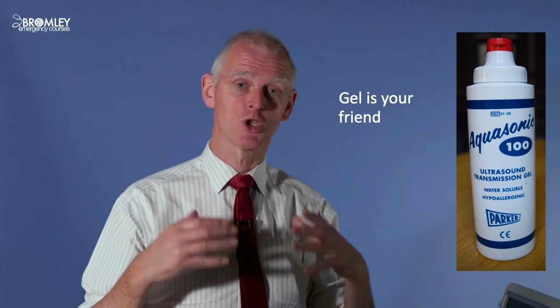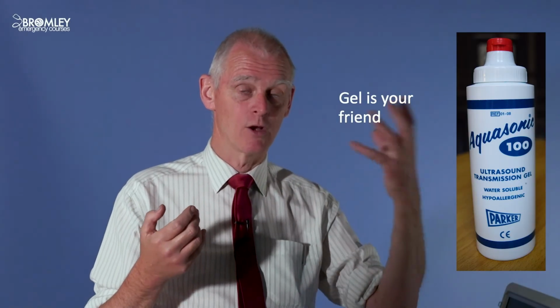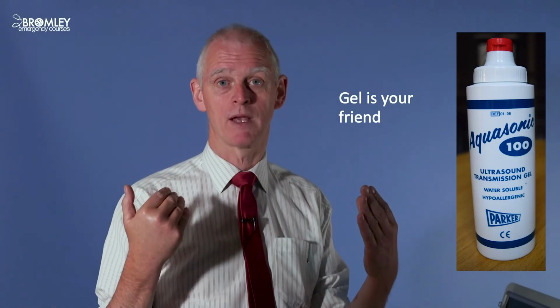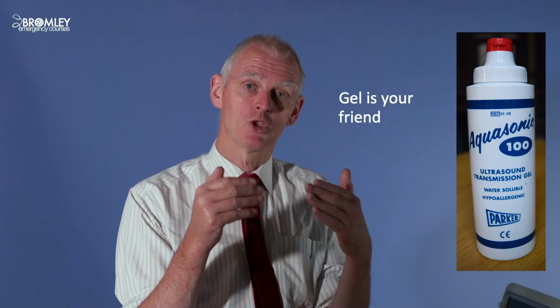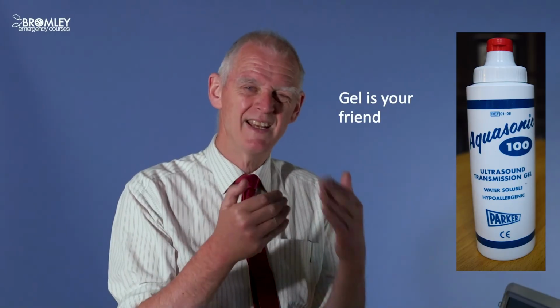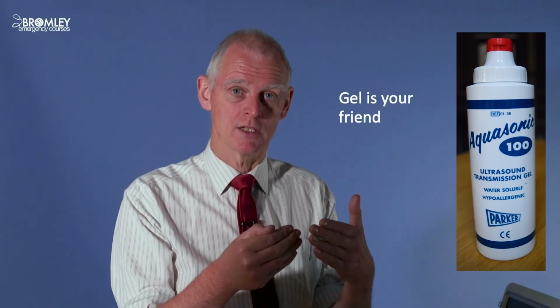So what is it that makes ultrasound bounce? If you think about shouting across a valley to a cliff, you hear the echo from the cliff on the other side. What is it that made that sound bounce back from the cliff towards you? Well, it turns out to be changes in the speed of sound. It's something called acoustic impedance, is its proper term. But if you think about it in terms of density, it's a change in density.